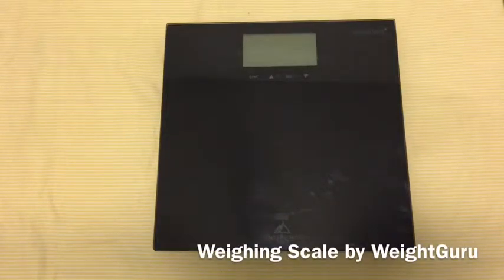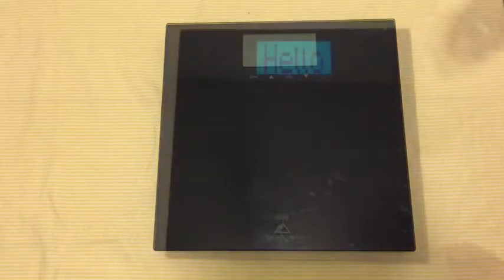Hello everyone, this is B for Try Me Once Reviews, and today we are reviewing the Weightless Weight Gurus weighing scale. This is a black scale and there are some very distinct features about this weight scale which are nice.